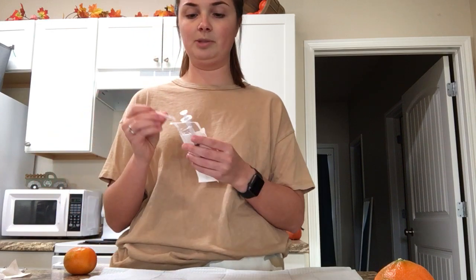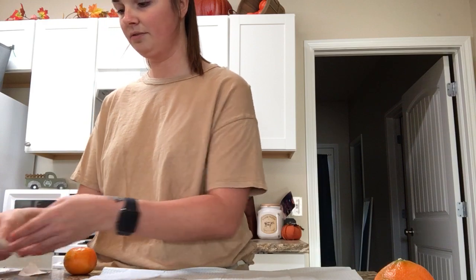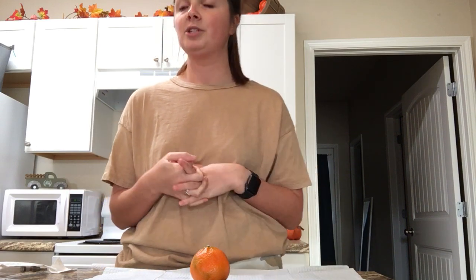Right now, this is my sharps container. Okay. So now we're going to say it's after lunch. My patient ate. And I'll document how the patient reacts to the Zyprexa. I think that's about it.